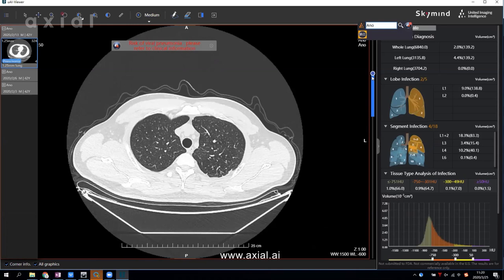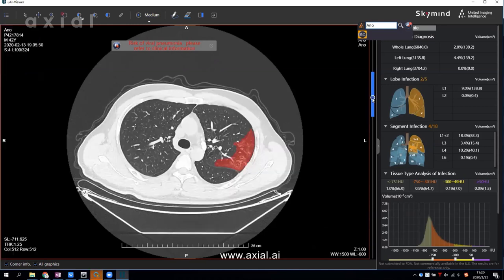You will see a warning message telling us that this patient has a high risk of viral pneumonia from coronavirus. This bar corresponds to the different slices, and the blue color shows the infection region. If you click here, you will see the infected region on the image.